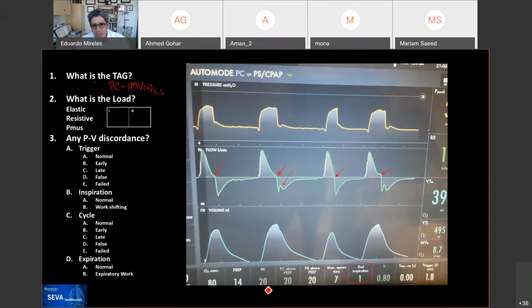And whenever the patient starts breathing on their own, the machine would go away and the patient would be breathing spontaneously. So technically it frees our respiratory therapists from having to be at the bedside throughout the time, and ensures that the patient was getting a minimum minute ventilation while ensuring that she was synchronous. So we took away the I time issue and the triggering issue by doing that. And so, questions about this?